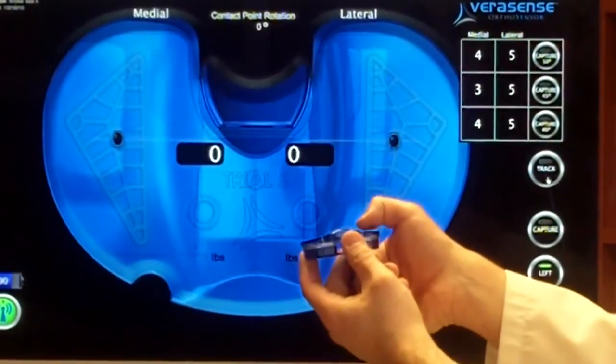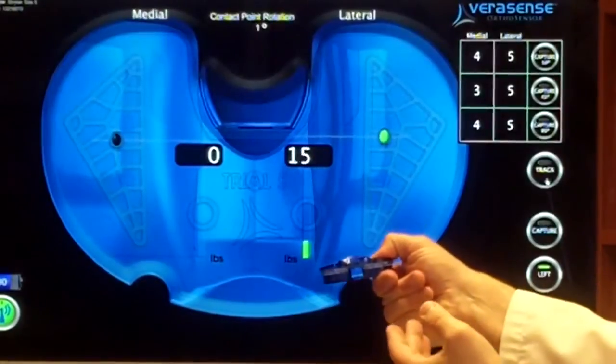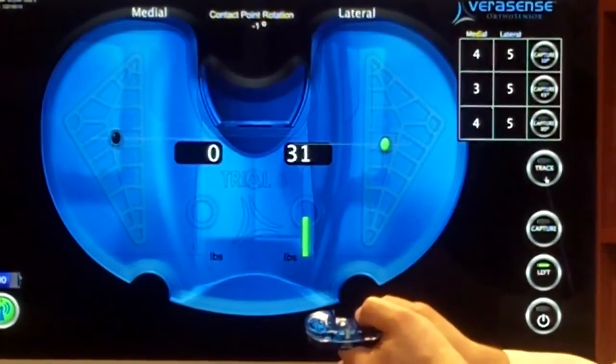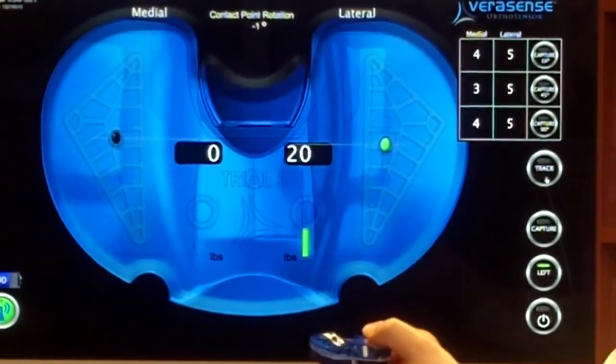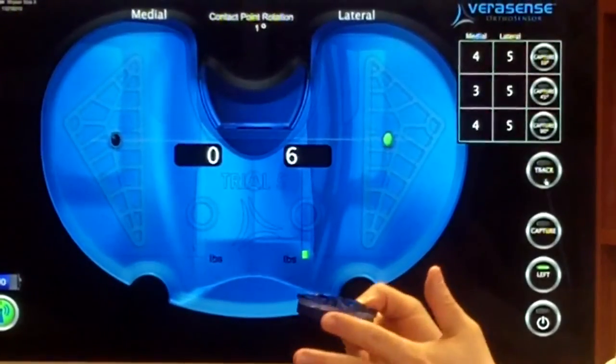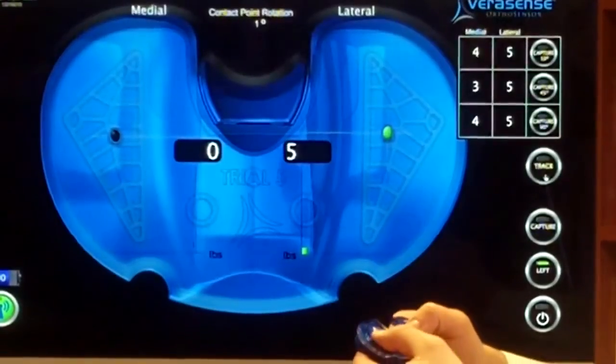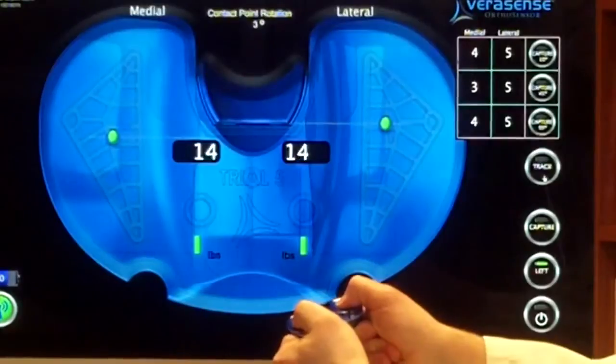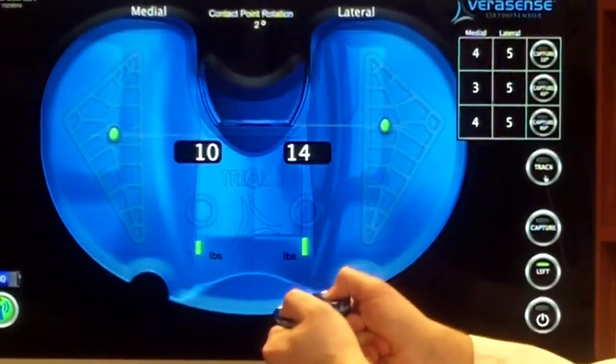So as I put pressure on the lateral portion here with my finger, you're going to see it's going to start to move up there. I can push as hard as I can, and I can get it only into the 30s. There's times you put the knee in and it's over 100, which is extremely tight, and that would be very painful for the patient. You want to see the numbers be roughly within 20 pounds of each other. Each unit is a pound.